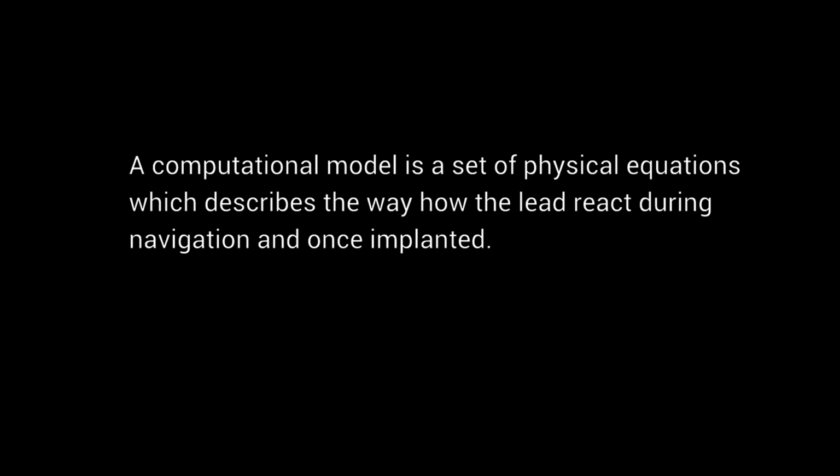The first and main part of what I'm doing is to develop mechanical behavior models for the pacemaker lead. So they are computational numerical models. And the idea with these models is to be able to represent in the simulation the way the lead will deform when subjected to constraints. To illustrate that, if you take, let's say, a metallic spring, and if you pull on it, it will pull back to go to its original rest shape. And the force with which it will pull back describes how it reacts to deformation.